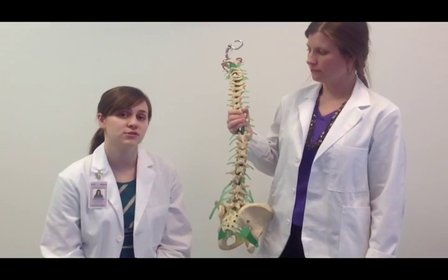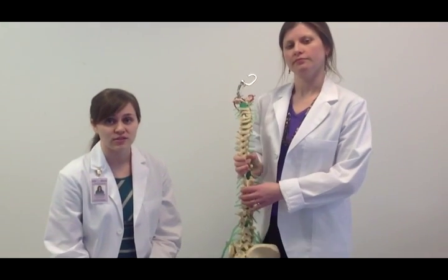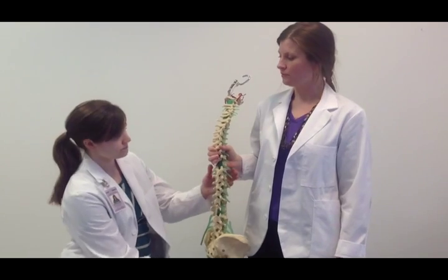My colleague is now going to share a little bit about the psychometrics of measuring lumbar rotation. To reintroduce myself, my name is Lindy Shelley, and I'll be addressing the psychometrics of lumbar rotation of the spine using inclinometry. Most studies look at the entire spine or the thoracolumbar spine and use goniometry. Very few studies look specifically at the lumbar spine for inclinometry, but one study we did find — by Olin and colleagues in 1992 — found that the psychometrics were good to moderate. We're going to move forward and demonstrate this on a real patient.